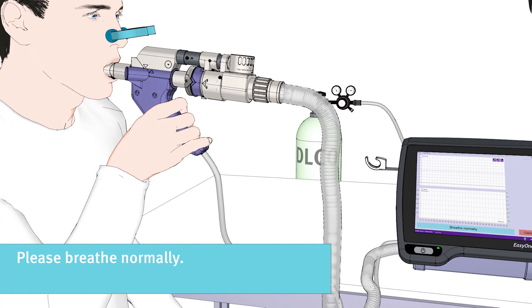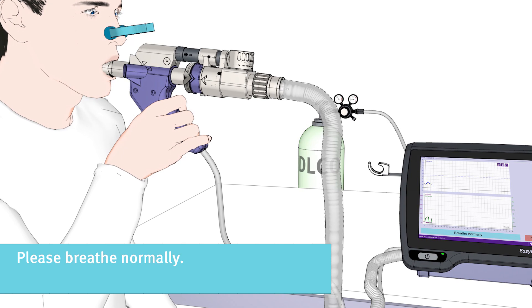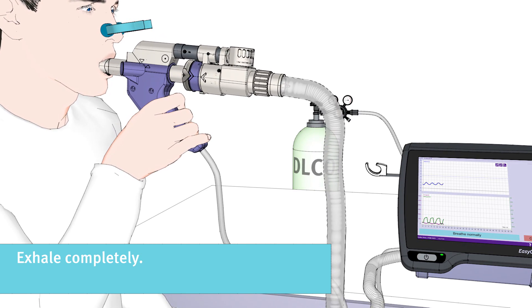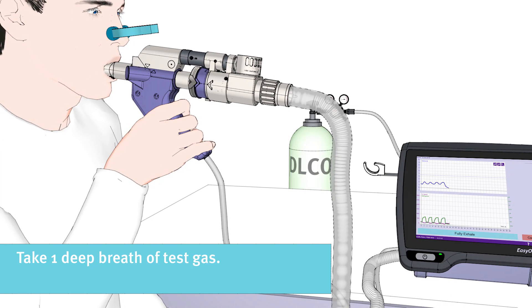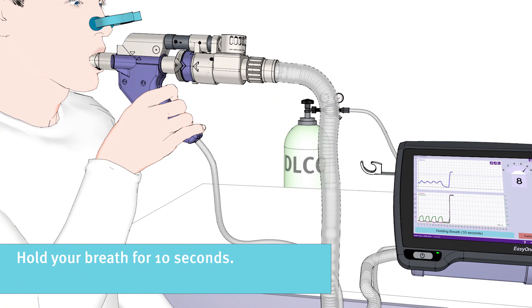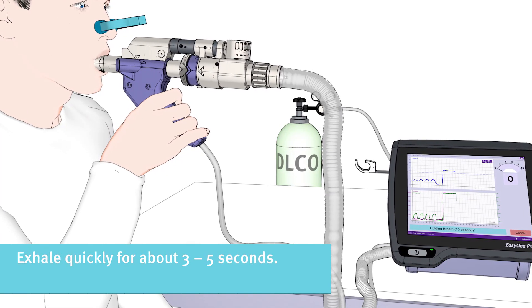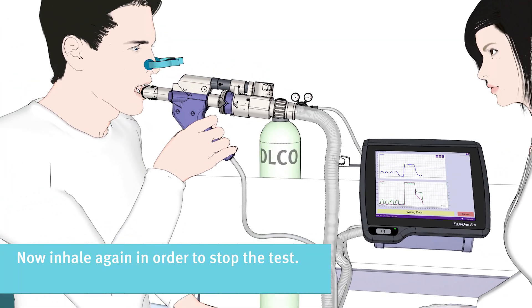Now, please breathe normally in the beginning. And then exhale completely. You will be asked to take one deep breath of test gas. Please inhale deeply and quickly, as much as you can. Hold your breath for 10 seconds. Exhale quickly for about 3 to 5 seconds. Now please inhale again in order to stop the test.